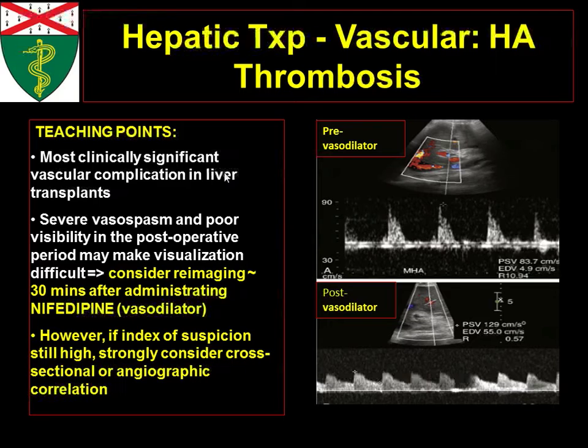As the technologist interrogates the main portal vein, gets flow, sees the hepatic veins, gets flow, looks for the hepatic artery, and can't find hepatic artery flow anywhere. And this is a fresh transplant. That's really worrisome, because if you're calling hepatic artery thrombosis, they have to go back to the OR and fix that. So that's a huge thing. You don't want the patient to go back to the OR if they don't have to. So they're relying on you.